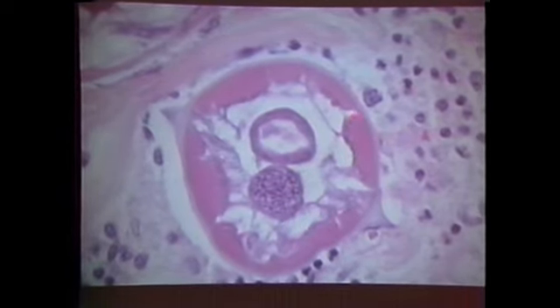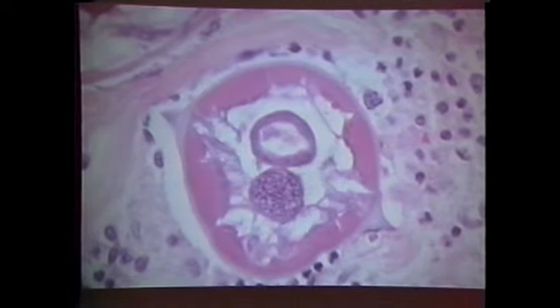The musculature is platymyarian. Okay, look at this, how pretty. What do you think? Is this a male or a female? Male. Intestine, this thing has a lumen, and this is sperm. Remember, eosinophilic globules with a dark nucleus. Look, platymyarian muscles, this is 1 muscle cell, and look at those nice lateral alae. That's a male Enterobius.